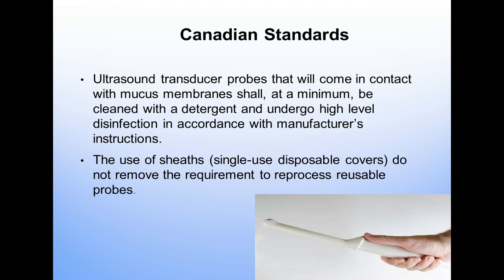So ultrasound transducer probes that come in contact with any mucous membranes shall, at a minimum, be cleaned with a detergent and undergo high-level disinfection in accordance with manufacturer's instructions. There are very different types of high-level disinfection out there today, so you need to assess all of those and develop policies within your health organization, what is best for you and safest.